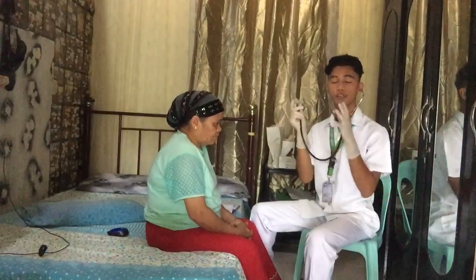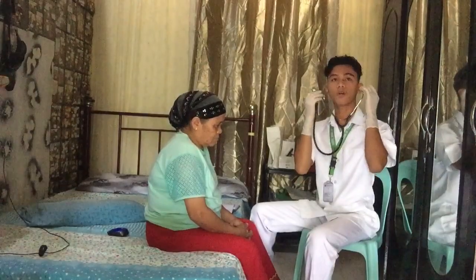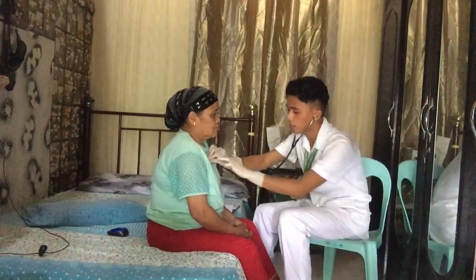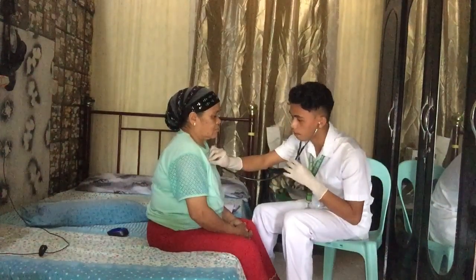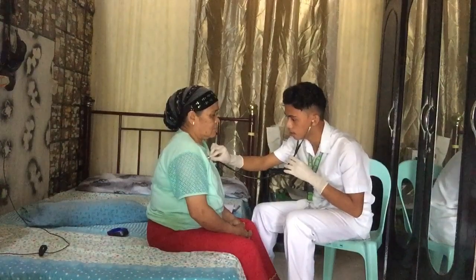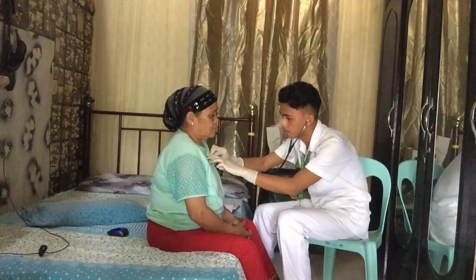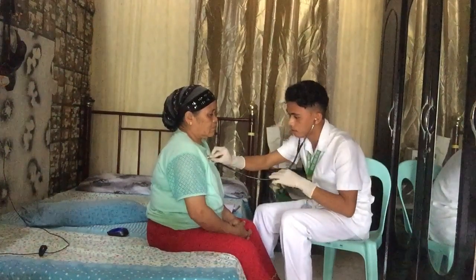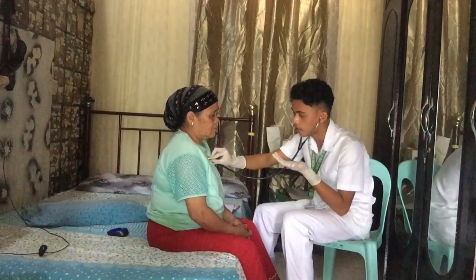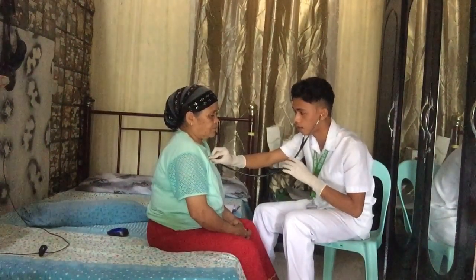But before that, make sure na open or closed ang inyong diaphragm. So let's proceed now to locate the pulmonic valve from the sternum. So this is the sternum, going to the left 2 finger breadths. So this is now the pulmonic valve. So you have to listen to it. Kung merong narinig na malakas na pulsations, that means that your patient has a problem with his or her heart.